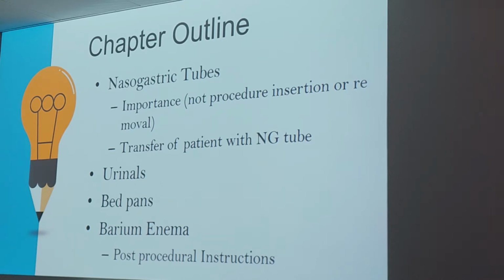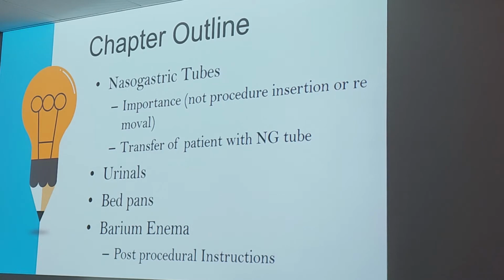So when you get an x-ray order, the ordering doctor might say abdomen x-ray, and then in the comments they'll say NG tube placement, okay? So we as x-ray techs do a lot of abdomen x-rays for NG tubes specifically. What is NG? Nasogastric tube.